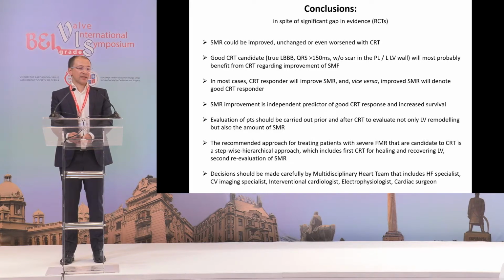Ono što se forsira u guidelinesima je da evaluacija pacijenta sa CRT-om treba da bude urađena i pre i posle ugradnje, ali evaluacija ne samo u smislu LV remodelinga, već i u smislu promene sekundarne mitralne regurgitacije. Trenutno aktivan pristup za tretiranje ovih bolesnika je graduisani pristup koji podrazumeva prvo implantirati CRT, a onda čekati određeno vreme i procenjivati da li treba još nešto da se radi, to je naknadno procenjivati stepen sekundarne mitralne regurgitacije ukoliko je ona postojala ili nije postojala na početku.